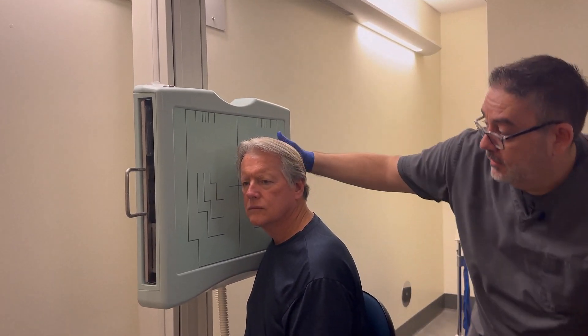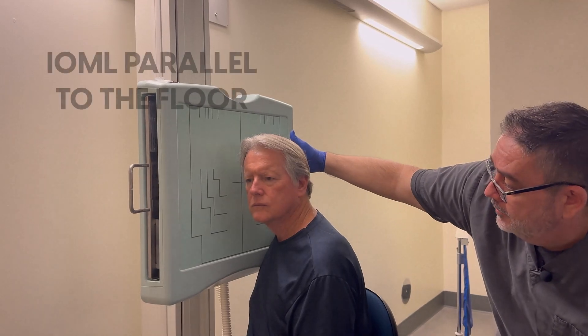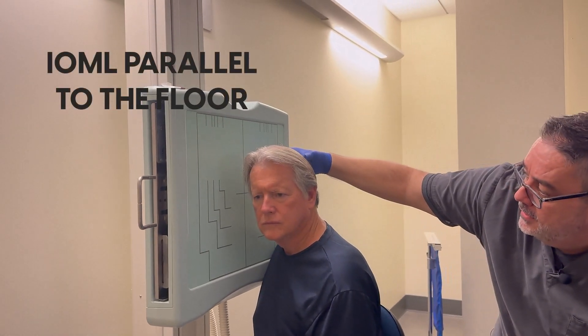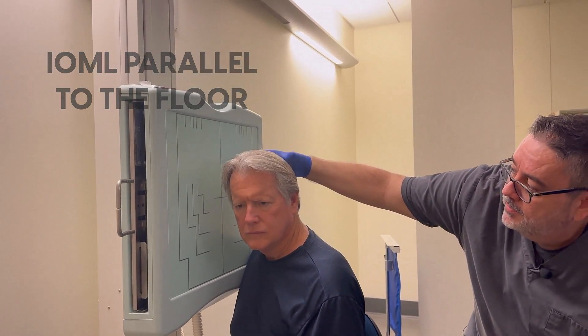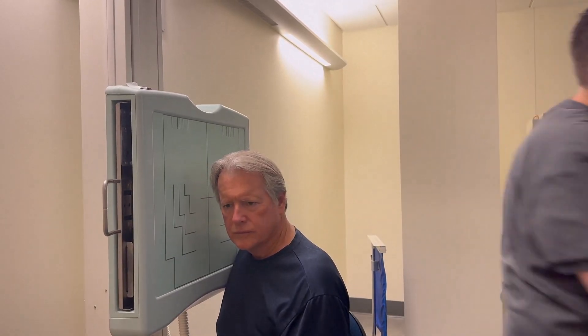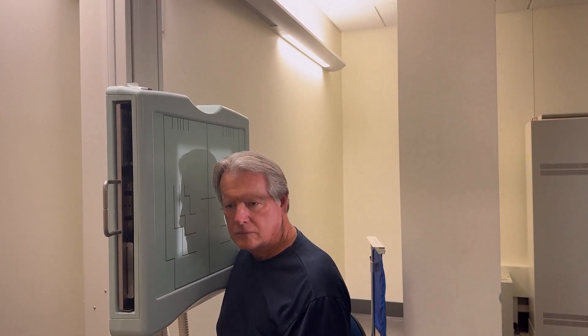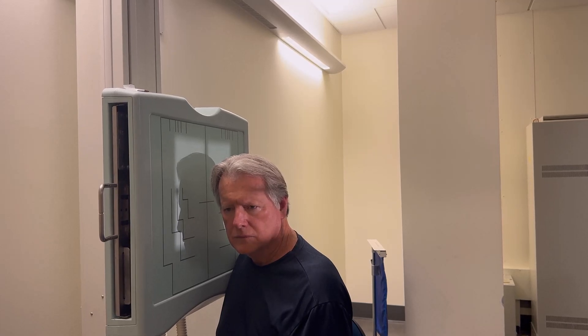Let me have you bring your chin down — tuck your chin in just a little bit. Right about there. So there's our IOML parallel to the floor. The central ray should be about two inches above the EAM.